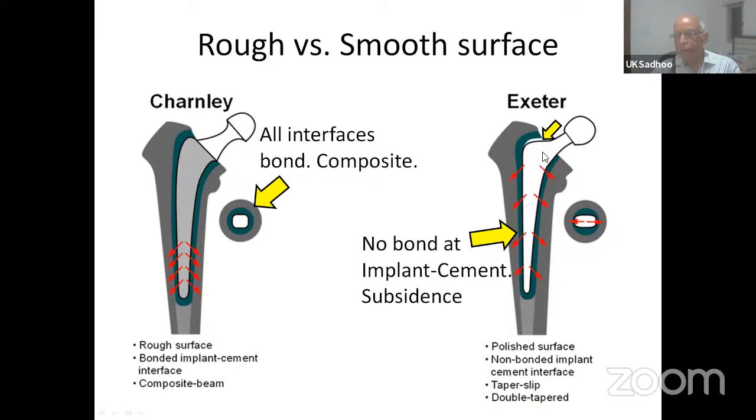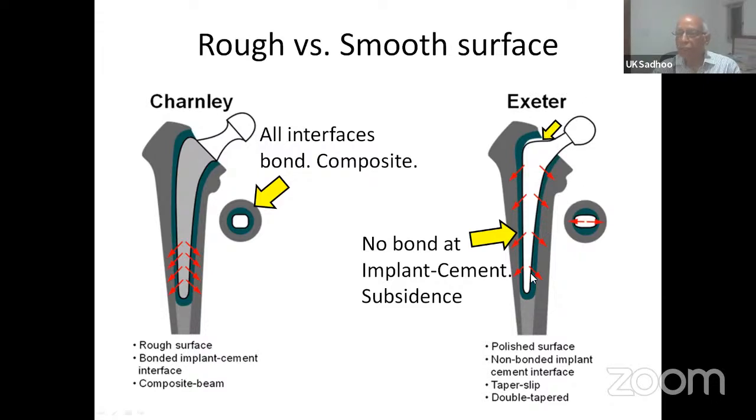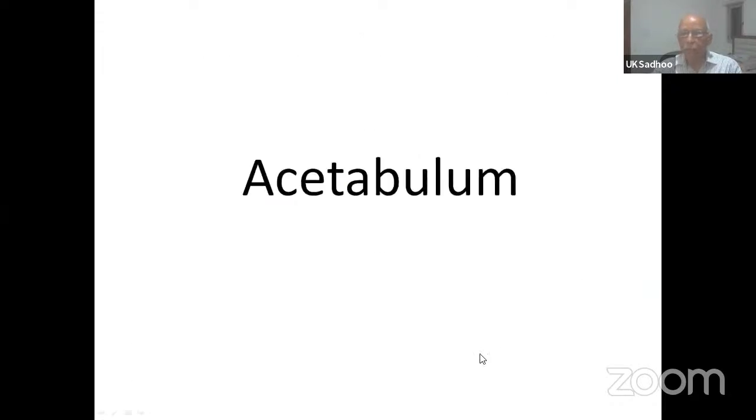Yet, if you need to take the stem out for any reason from the bone and cement complex, all you need to do is clear the shoulder and yank it out. Just hammer it out. It comes out pristine. You don't have to debond the stem from the cement. Okay. So much for the stem.